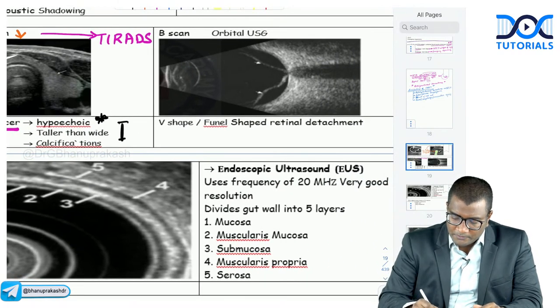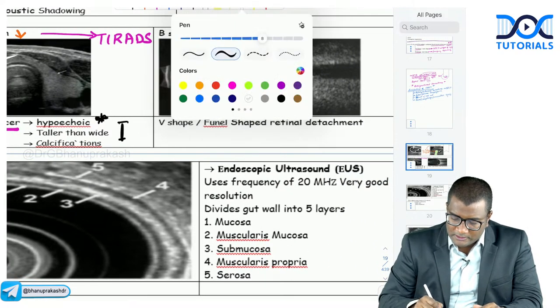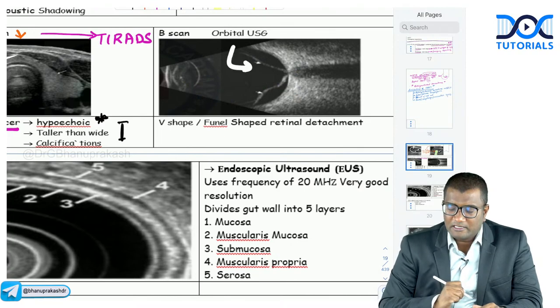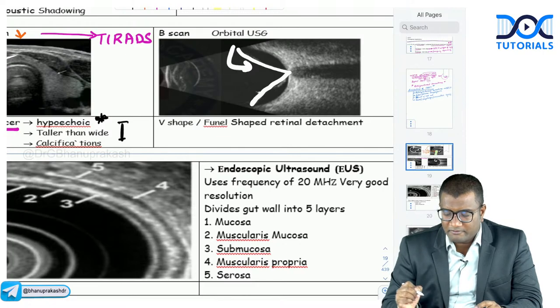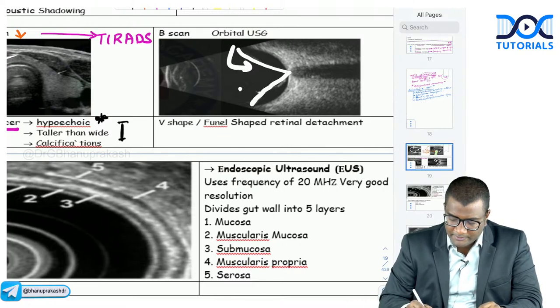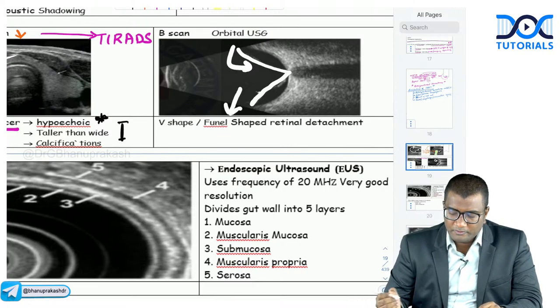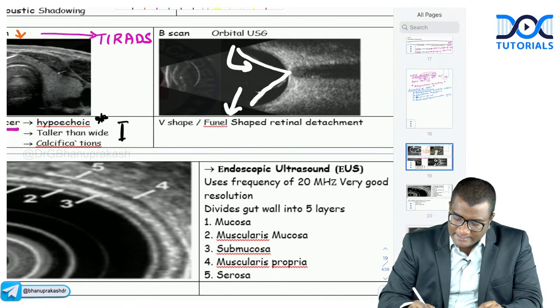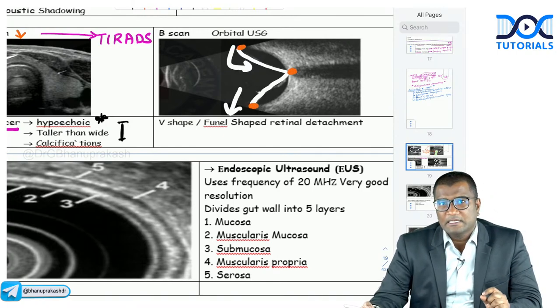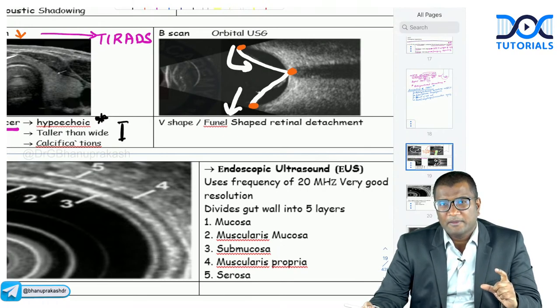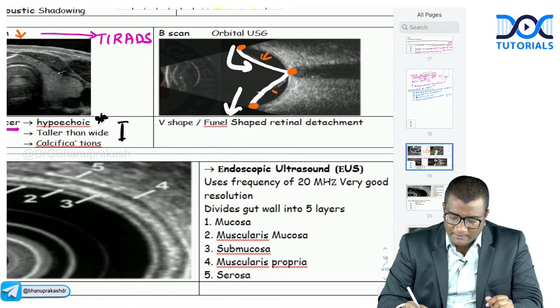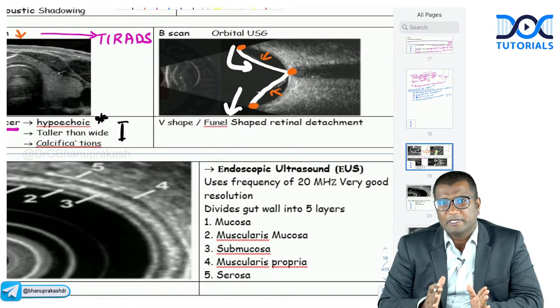This is an orbital ultrasound showing a V-shaped or funnel-shaped retinal detachment. The retina is tightly attached at the periphery (ora serrata) and at the optic disc. Detachment occurs in the middle, giving the characteristic V-shape or funnel-shaped appearance on orbital ultrasound.